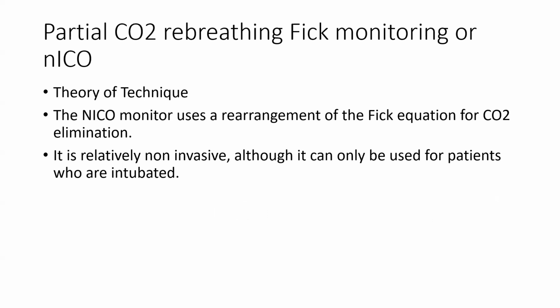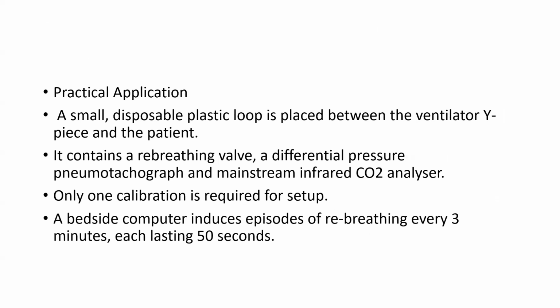Partial CO2 rebreathing, Fick monitoring, or NICO. The NICO monitor uses a rearrangement of the Fick equation for CO2 elimination. It is relatively non-invasive, although it can only be used for patients who are intubated. Practical application: a small disposable plastic loop is placed between the ventilator Y-piece and the patient.